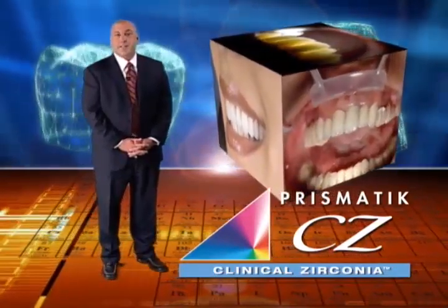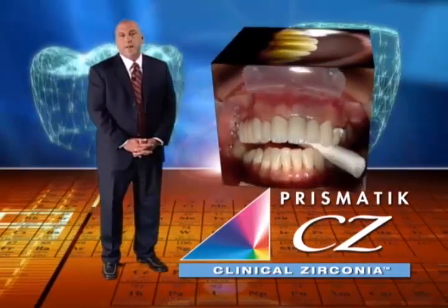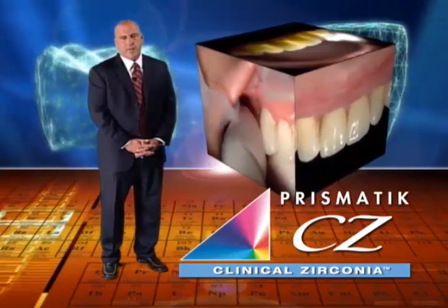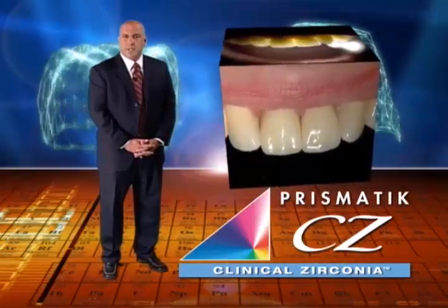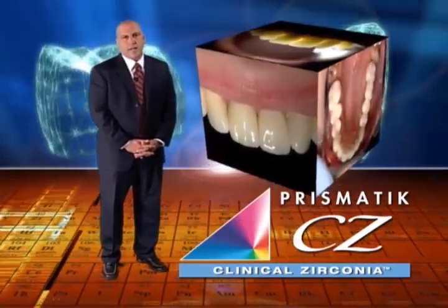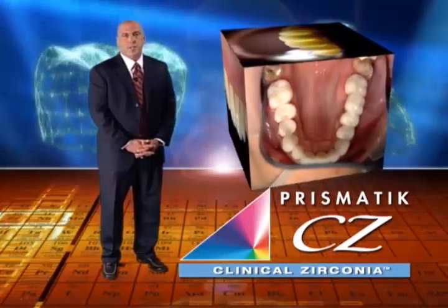Recently, technology has allowed us to fabricate high-strength all-ceramic restorations. In fact, these all-ceramic restorations are so strong they can be conventionally cemented and placed in almost any clinical situation. As dentists, we love to place these restorations, but there's always one big question: how long are they going to last?